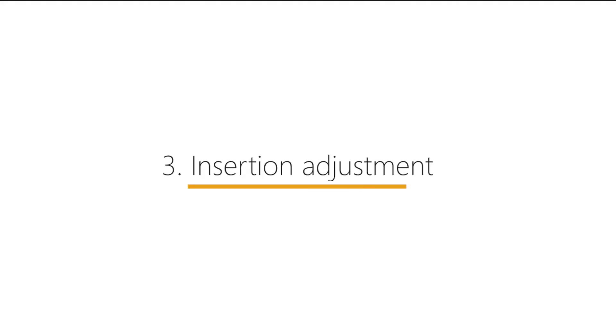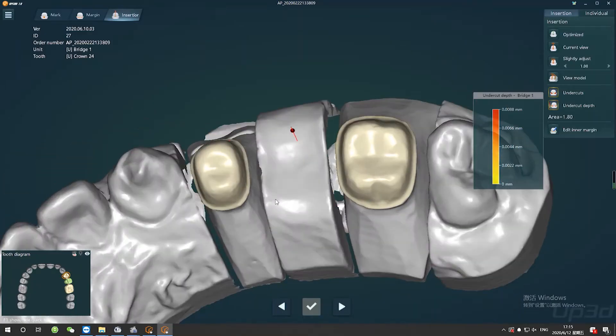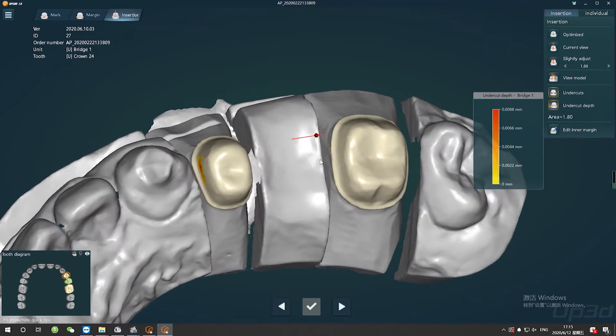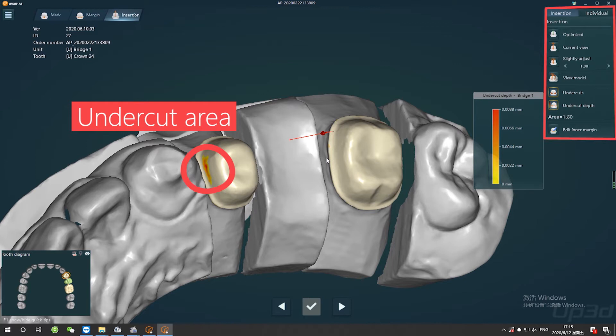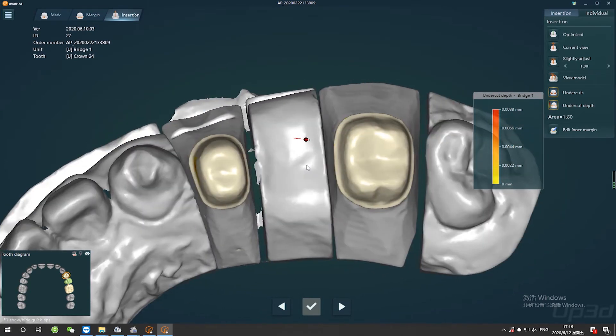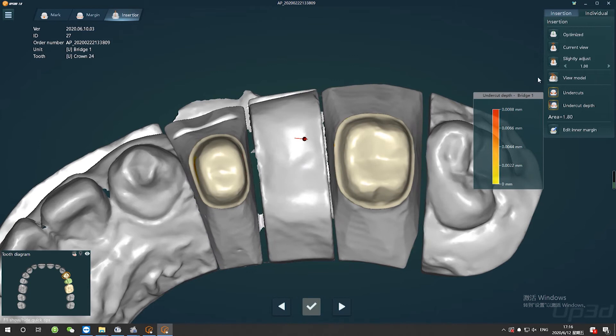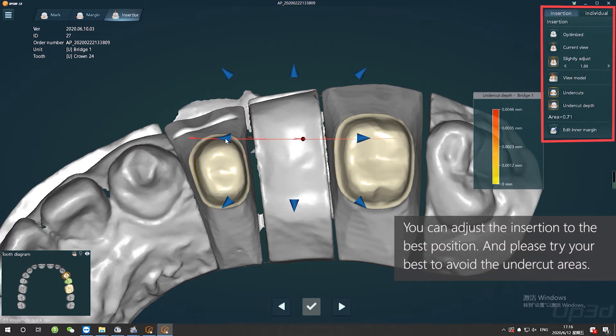Well, we are going to step 3, Insertion Adjustment. You will see a right insertion because the software may optimize insertion to you. When you are moving it, you will see some red and yellow areas on the tooth, the undercut areas. But we need to avoid them. So, please adjust tooth to a correct position without any color, just like what I'm doing now.